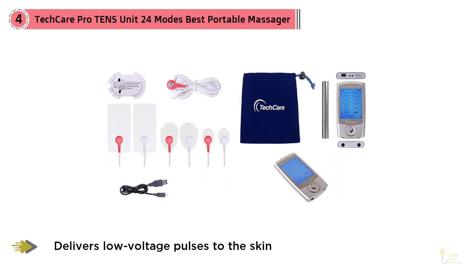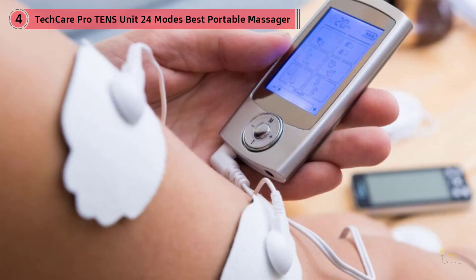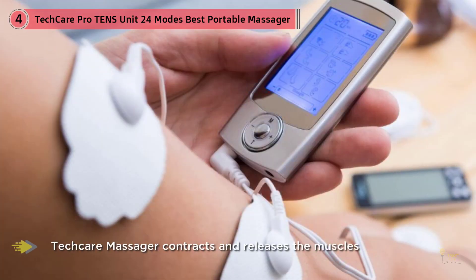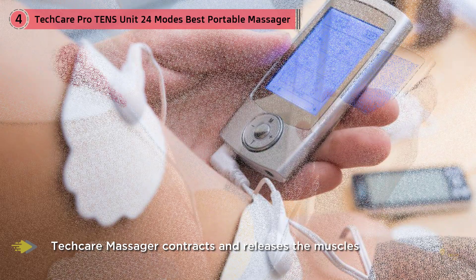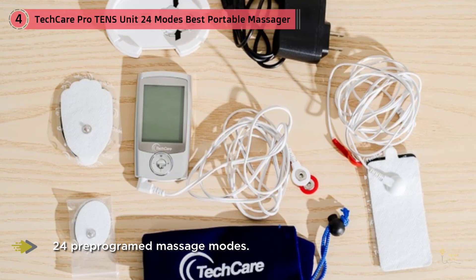You can connect up to four sticky pads to the electrode cables, allowing you to treat multiple areas at once. With 20 intensity settings and six modes of current pulse — more than on most units we tested — the Pro 24 gives you a wide range of options to make the current feel subtle or strong. The large, bright screen is easier to read and less crowded than the display on any other device we considered.